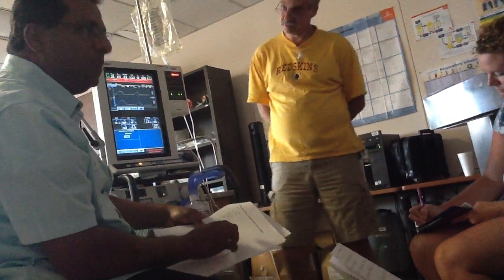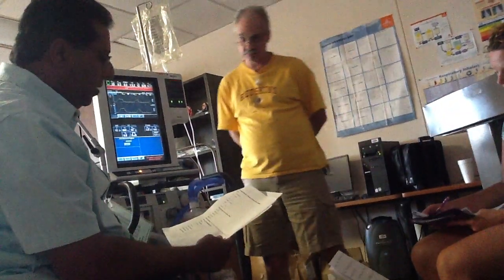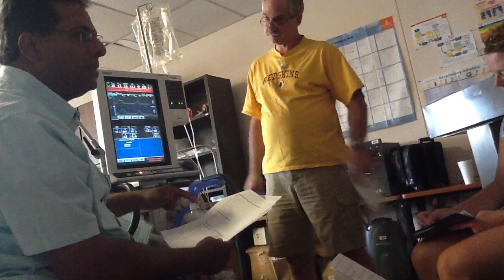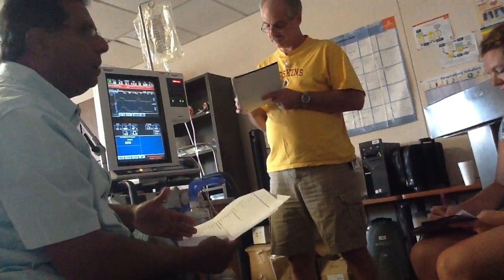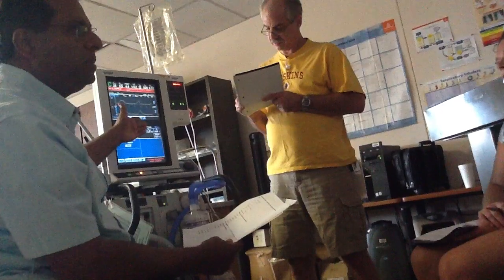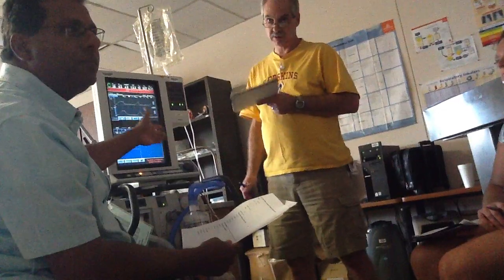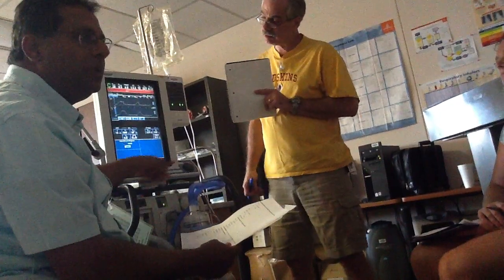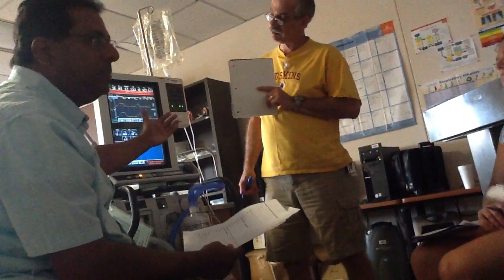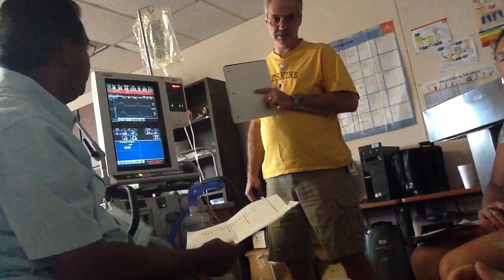But your paper is a different patient, so it says 28, right? Let's go along with the paper because I don't want to mess up the whole flow of things. But if I ask you what this particular patient is doing, you would tell me plateau minus PEEP, and you would check the plateau. How do you get your plateau? Inspiratory hold. If you don't do inspiratory hold, you don't get a plateau. Then you'll be confused. So that question might be asked. How do you do the plateau?